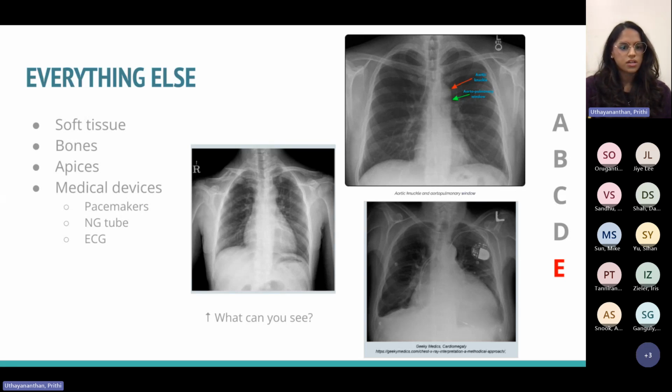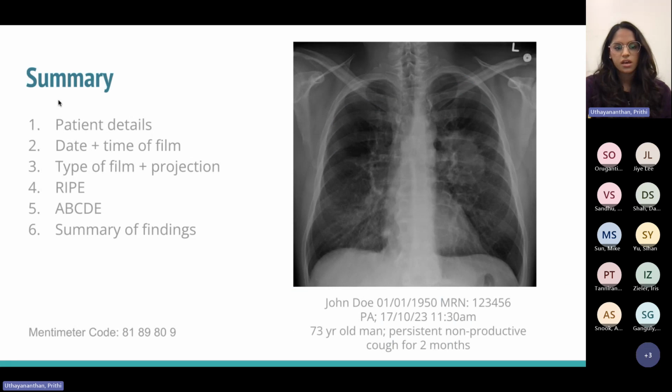Okay, so this is just a summary. I can present this X-ray to you just so you can see how it should be done in OSCEs. I think it was quite useful to hear that when we were in your position last year, because you just want to hear what you can say and then replicate that and keep a structure in mind. You'll pick up your own style of presenting as you do more.